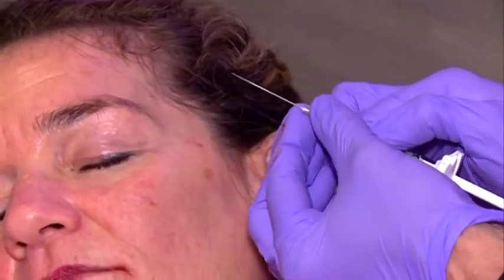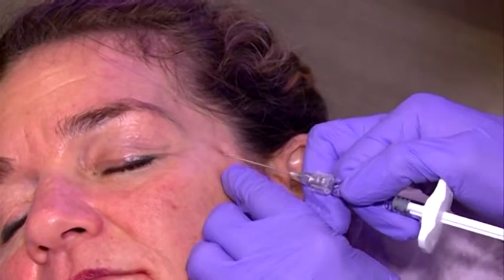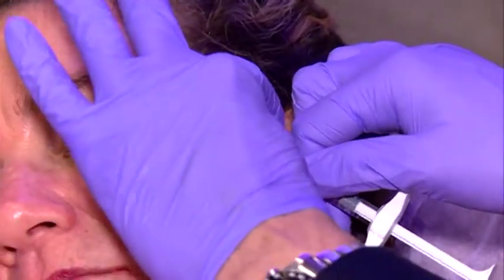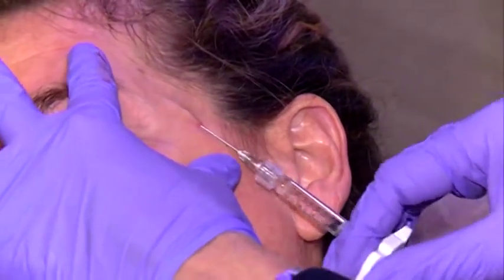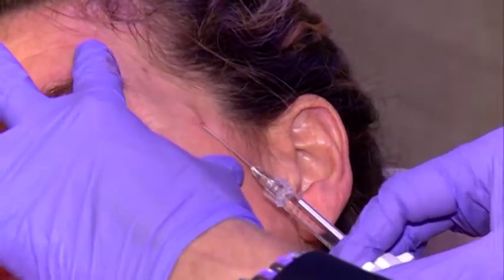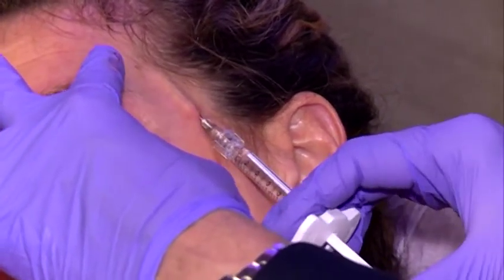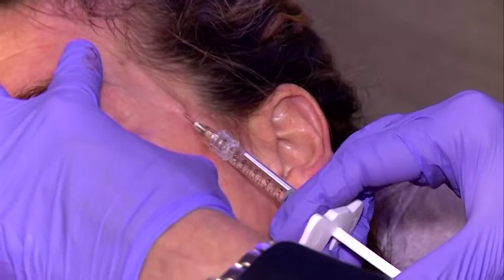You see how it's not flexible at all. It's very stiff. Bevel is up. Stretching. Subcision. Gentle. She's very nice. If the patient has pain, I place some product in here because it's with lidocaine.